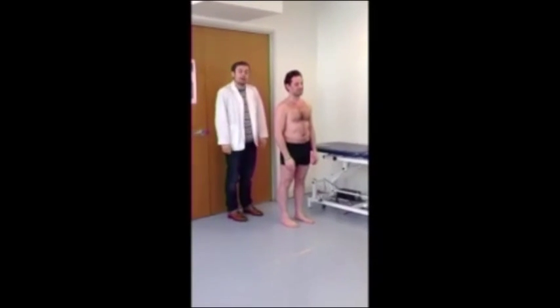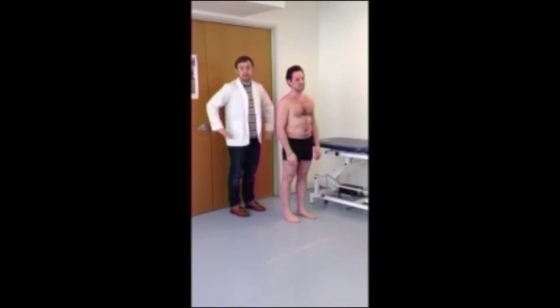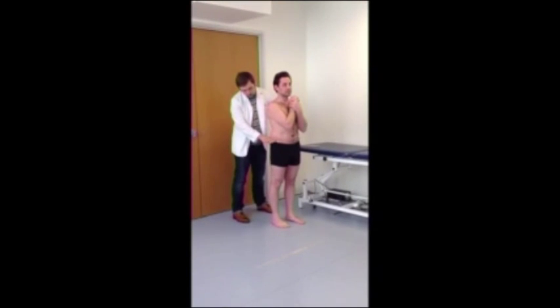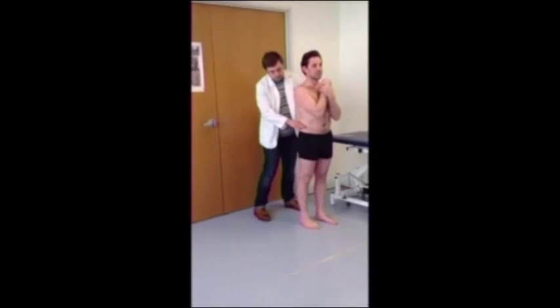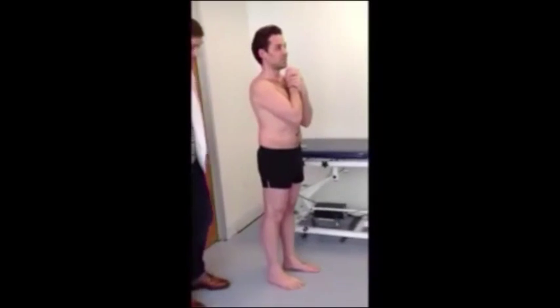Yeah. Alright, so first we're going to find the iliac crest, which is at the top of the hip bone, and this is where we're going to put the axis of our goniometer. So I'm going to start out on the hips, and then move up until I get the top of that hip bone.